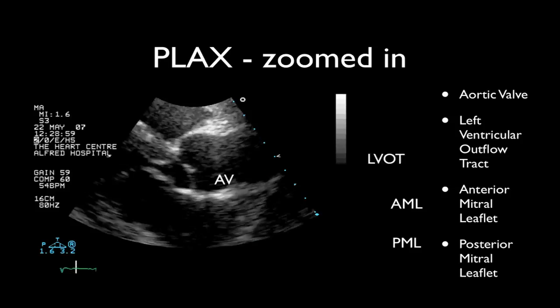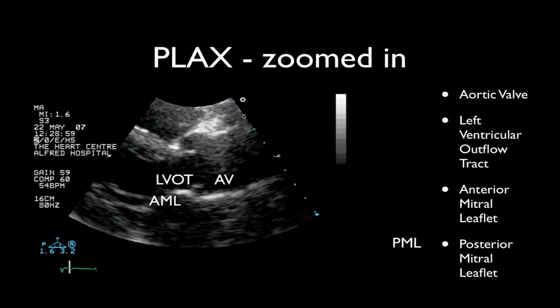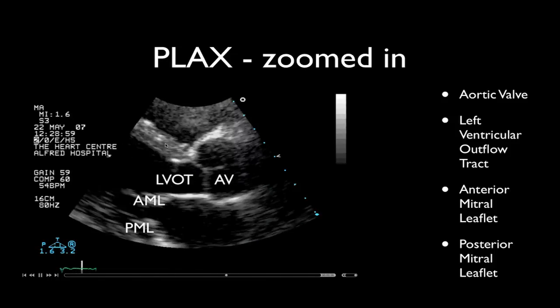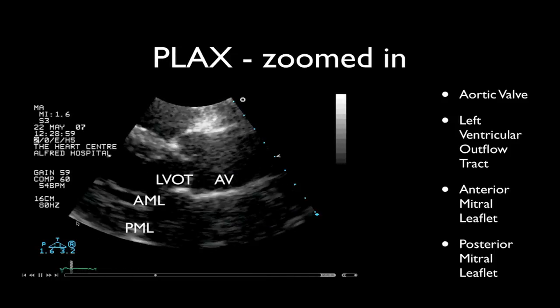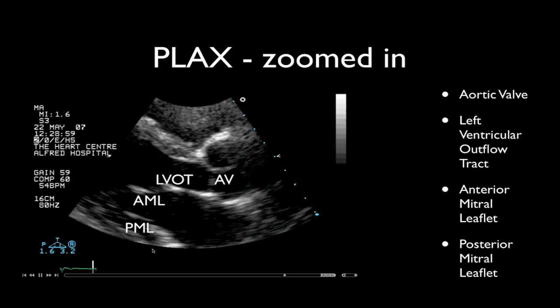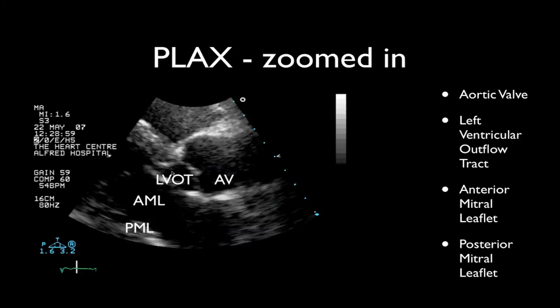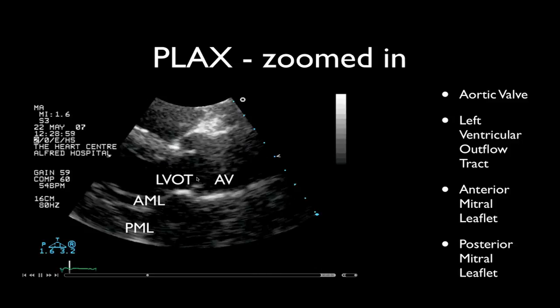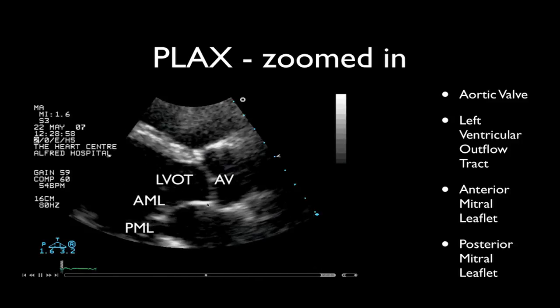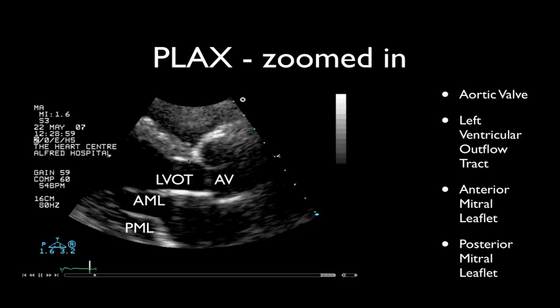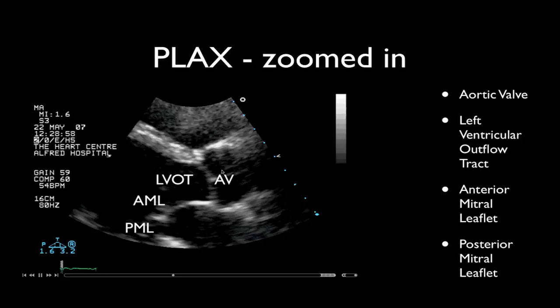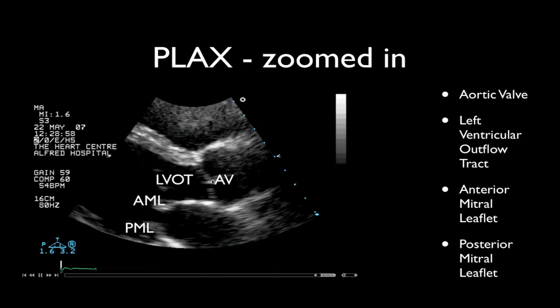This next image is a zoomed-up view of the left ventricular outflow tract. We have the left ventricular chamber, anteroseptum, posterior wall, mitral valve with anterior mitral leaflet and posterior mitral leaflet, and this is the left ventricular outflow tract formed by the anterior mitral leaflet and the basal anteroseptum just before reaching the aortic valve.